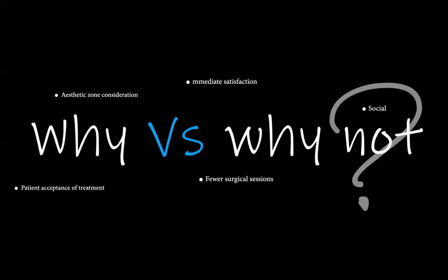So let's move on. Why should we do an immediate loading? These are a few reasons why a patient needs to get an immediate loading. For example, an aesthetic zone consideration. I can manage that better if I am taking out a tooth and I can place an implant at the same time. There are papers on that, on whether you would lose as much bone if you simply bone graft it and come out versus putting an implant in there.